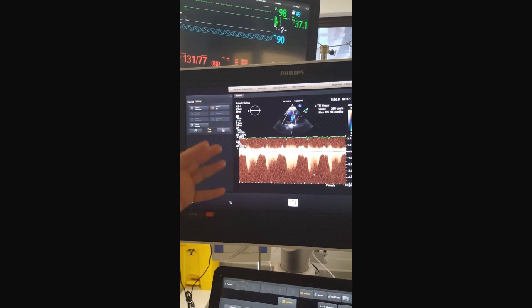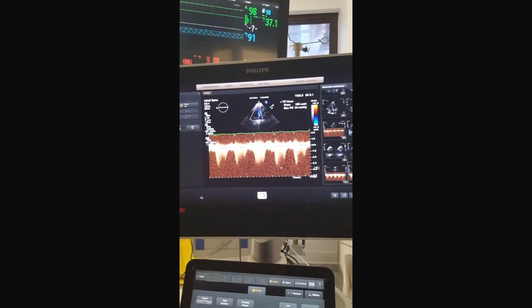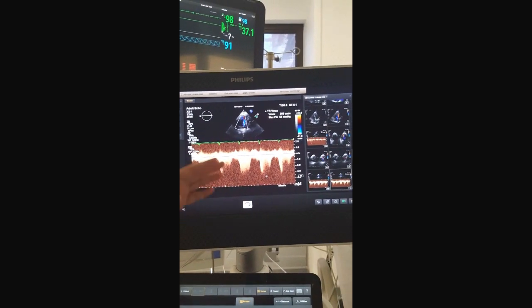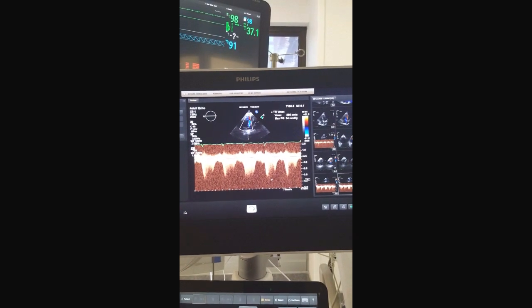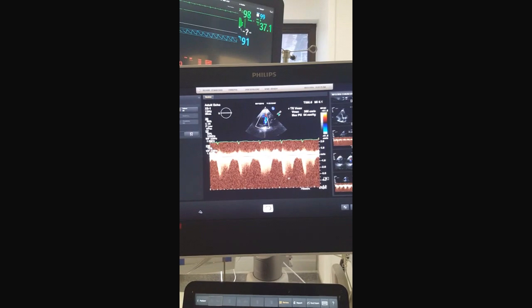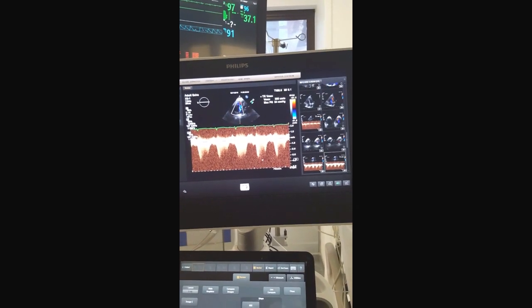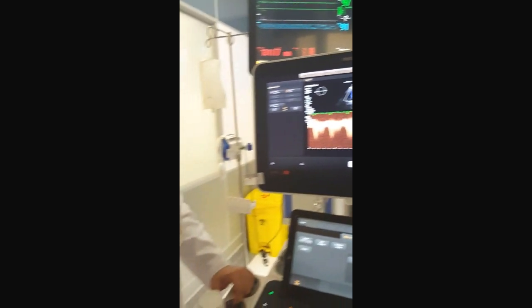But if the patient has a dilated right ventricle or right atrium, we usually add 5 to 10. Dilated IVC and non-collapsing, add 20. So this patient roughly has a pulmonary pressure of about maybe 70 to 75. To be honest, 75. Yeah. Okay. The last image, which is important, we couldn't take in this patient because of heart condition and obesity.